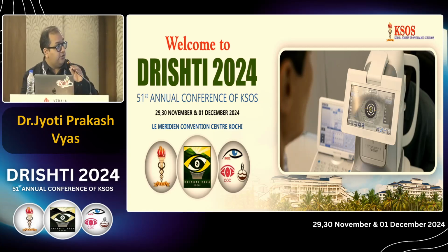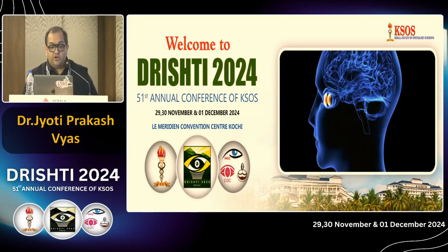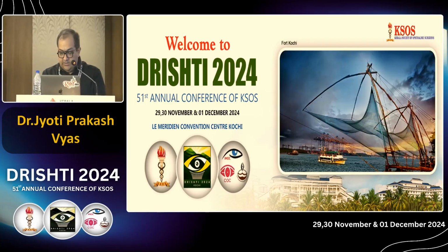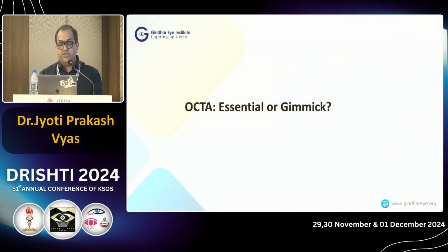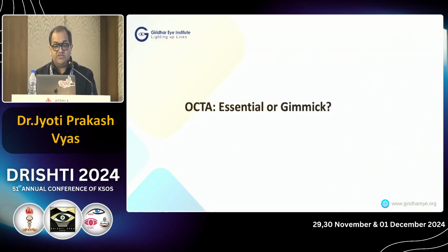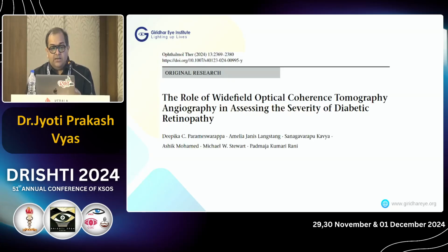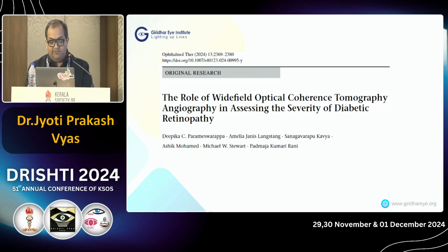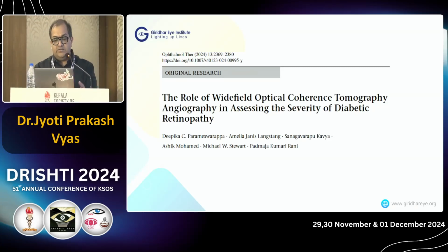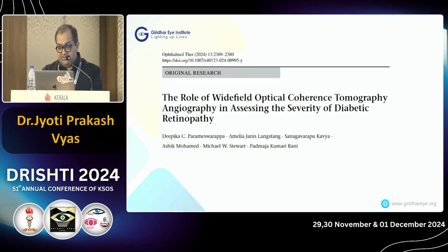After all these wonderful talks, I'll be talking about applications of OCTA in the diabetic eye. The first question which sprung to my mind when I first heard about OCTA was whether it's an essential investigative modality or just a gimmick which is there in the market for us to play with. To answer this query, I looked into the recent literature, and I stumbled upon two recent articles. You can see these are published this year itself.